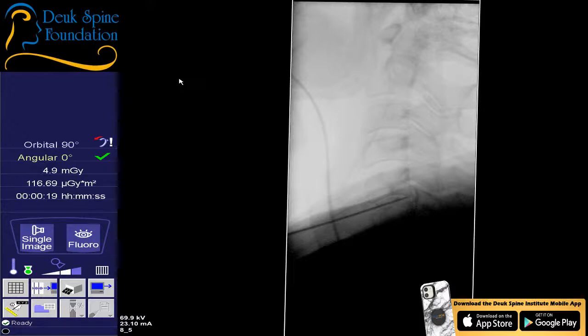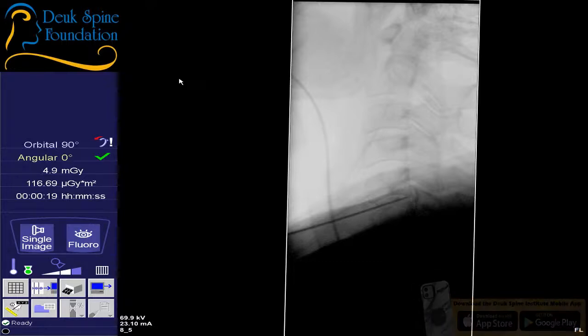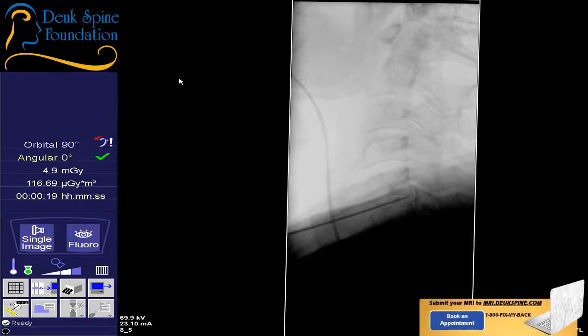If you look at the needle, you can relax. We're not going to take a picture just yet. If you look at the needle tip on that last fluoro shot, it's a lateral view, you can actually see the dye behind the disc, for those of you who know where the disc is, and it's outlining the herniation. It's a good size herniation, actually. But on the MRI, you can never really see it. Not like that. On the MRI, it looks small. And that's just because MRIs are not entirely reliable to tell us where the problem is for sure.